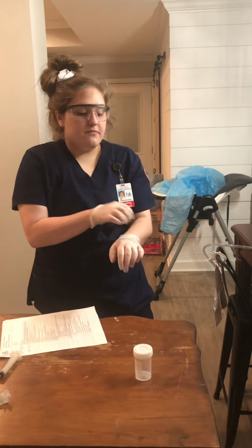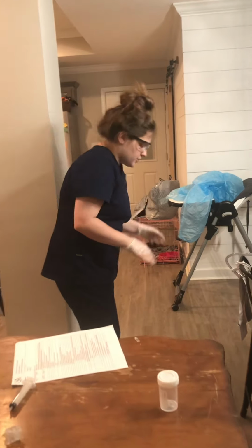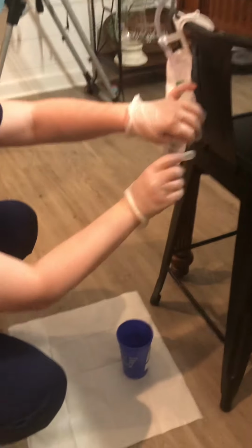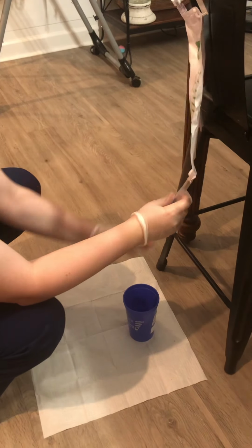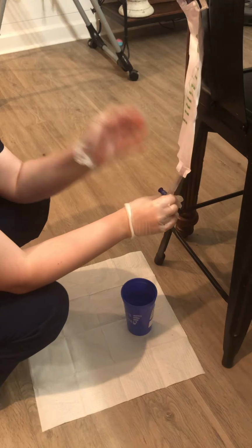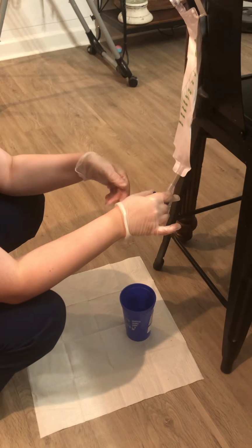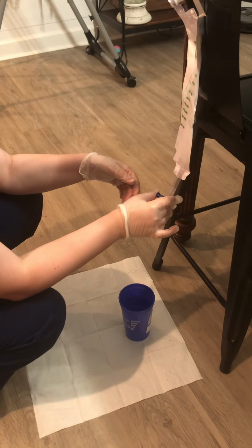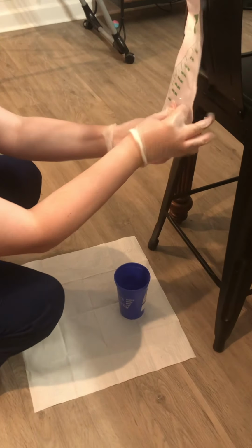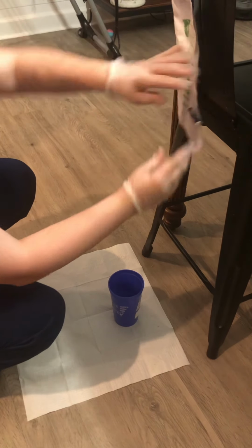So first you're gonna want to drain your bag. So you come down here, you get your towel, get your graduated cylinder again, take this out, and it would be lower obviously, but do the same thing. You're gonna open it up, let it all drain out to the graduated cylinder. That way you can measure the urine as well as drain your bag. Then after it's done, you just put it back. You're gonna document the amount and clean up down there.